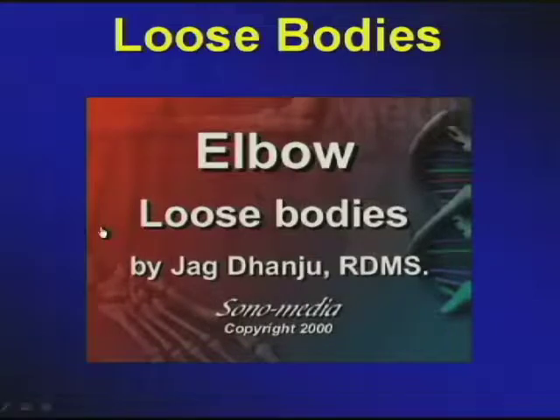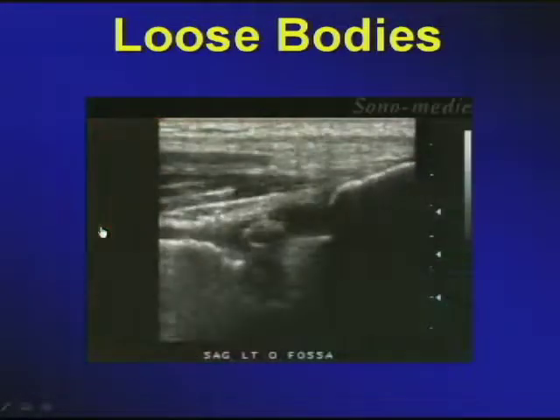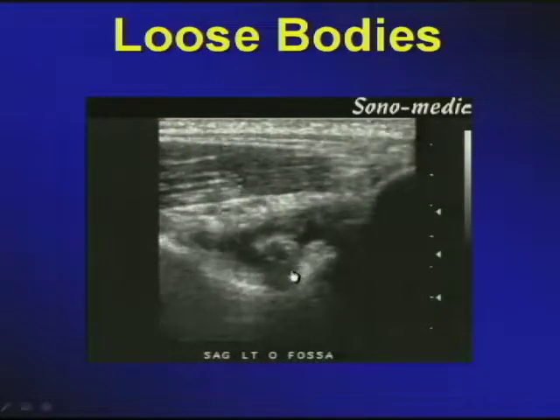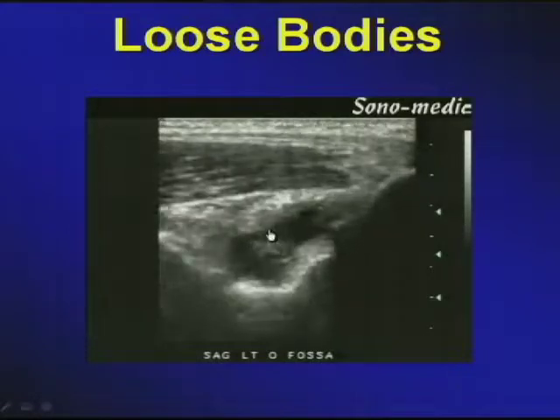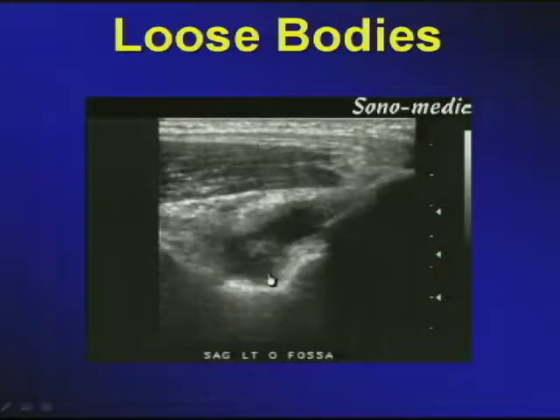It is not until you look at the video clips wherein now you begin to appreciate the loose bodies. Why? Dynamic imaging permits us to show not only in both long axis and short axis, but we could see the mobility and the translation of the loose bodies.